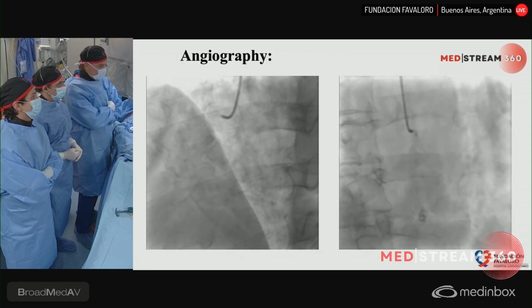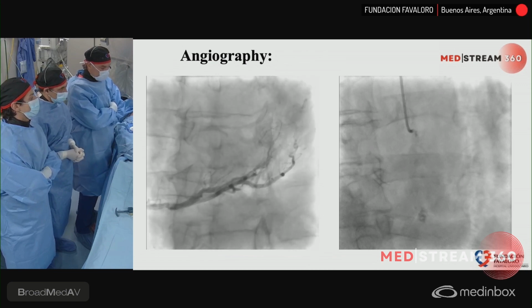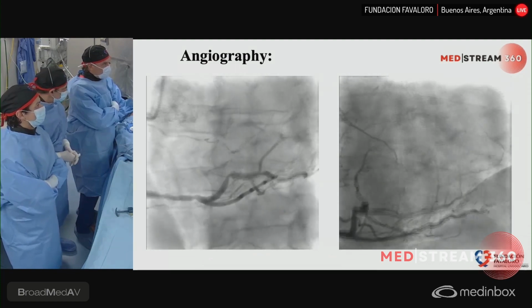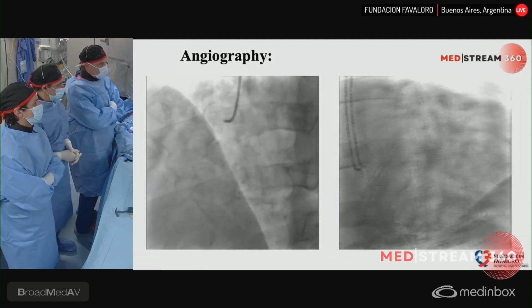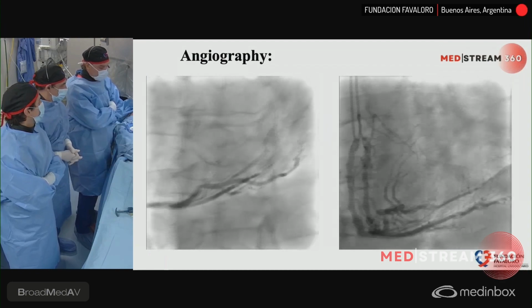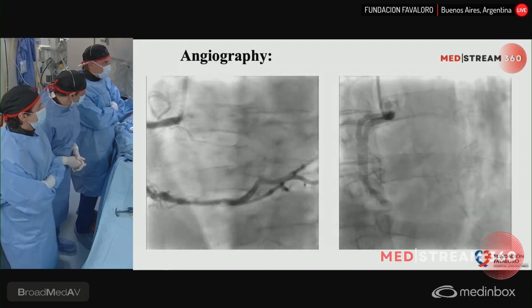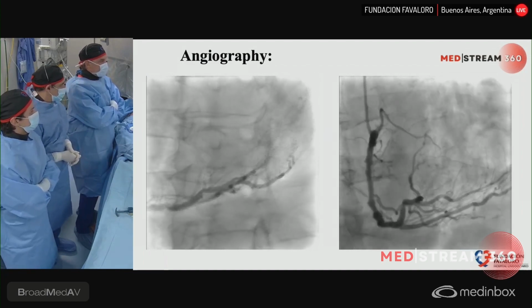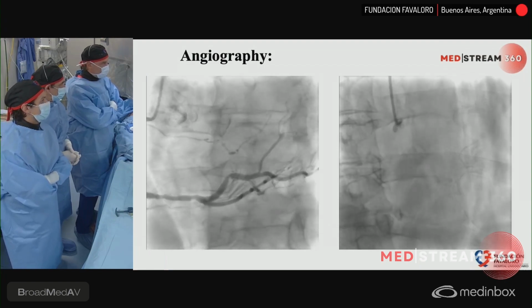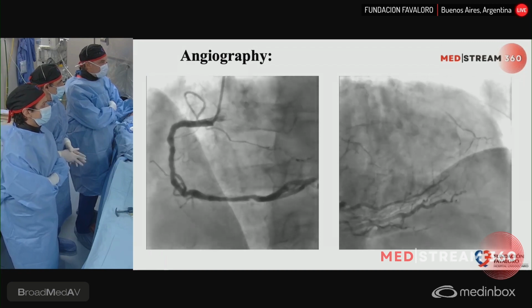Next. So for all those reasons, this patient was considered high risk for ischemic disease, considering that he was symptomatic with arrhythmia, with the changes on the ECG, and with a significantly positive stress test. So the patient was referred for angiography. This is the big right coronary artery with diffuse disease, but not significant stenosis in our consideration.